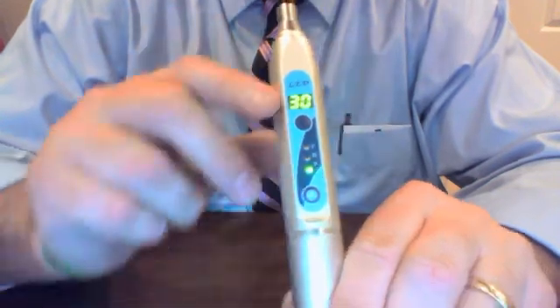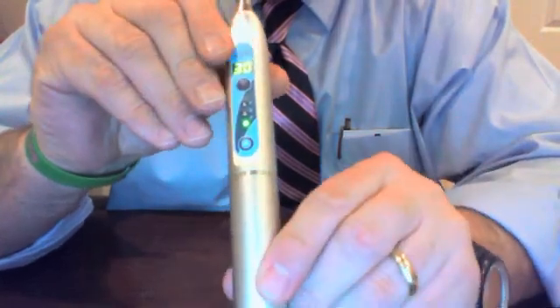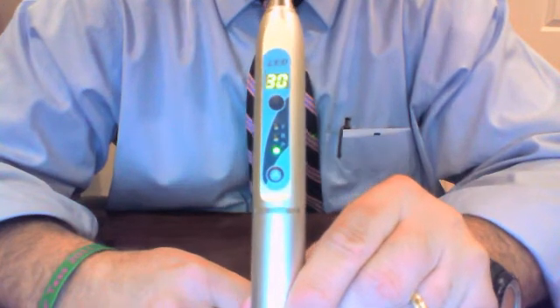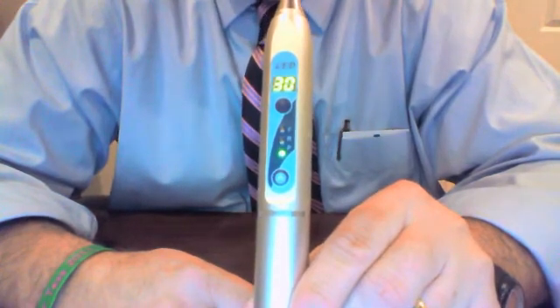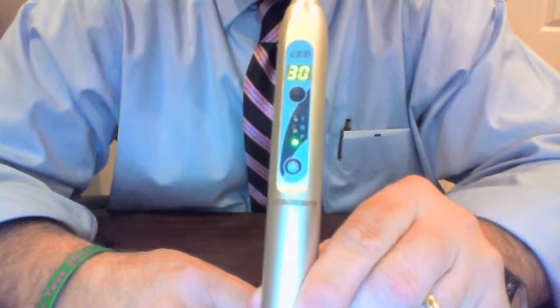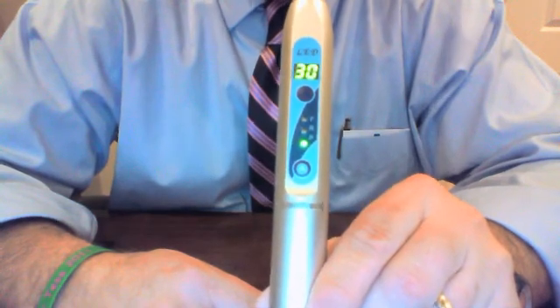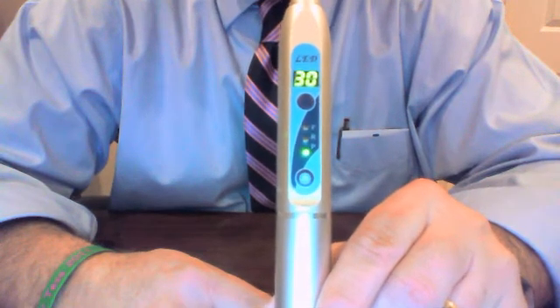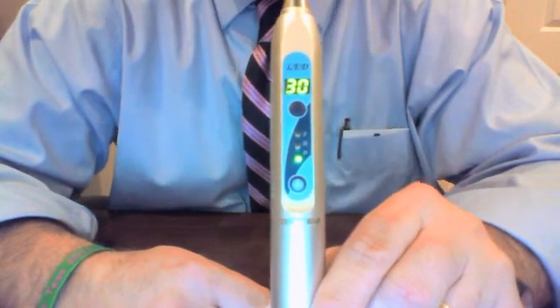Another very nice feature of the CureFX cordless light is no fan, so you're not going to have any annoying noise, unlike some of the bulkier lights and other cordless lights out there. At Diversident, we sell the CureFX light, a tip replacement, battery replacement separately, a radiometer, the eye protection shield separately, the tacking tips, and the different barriers illustrated earlier.